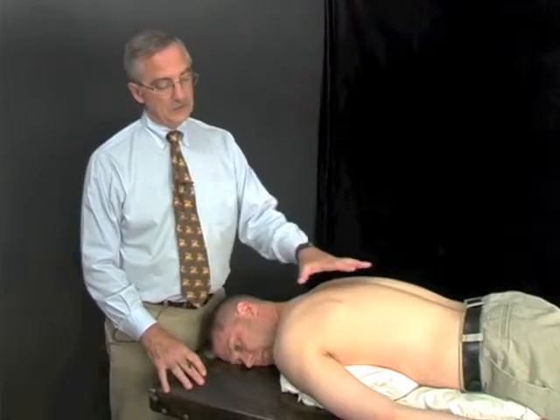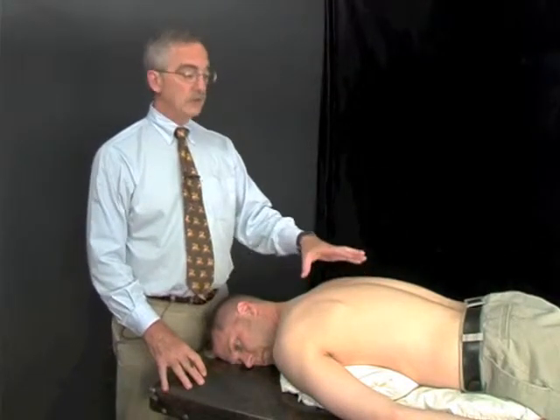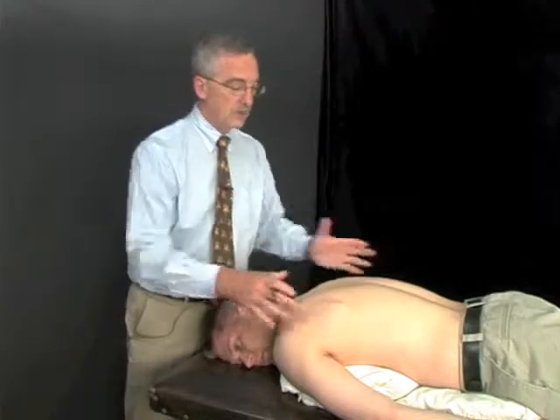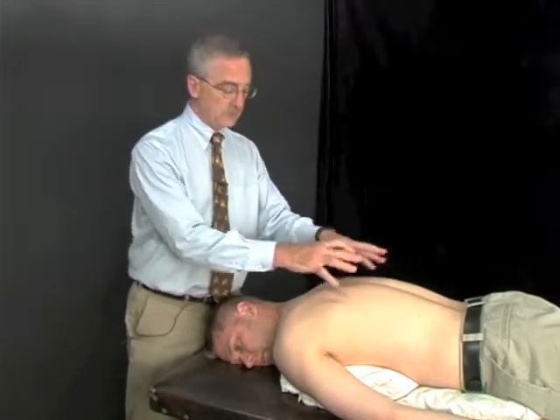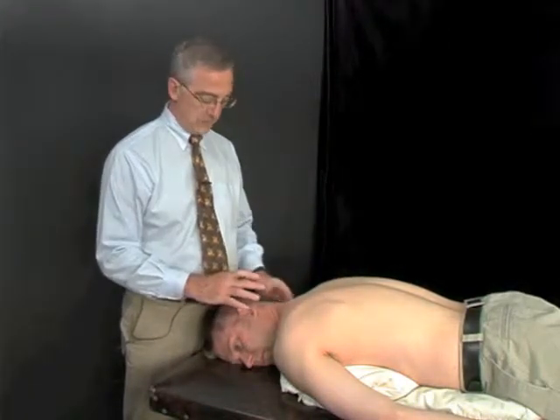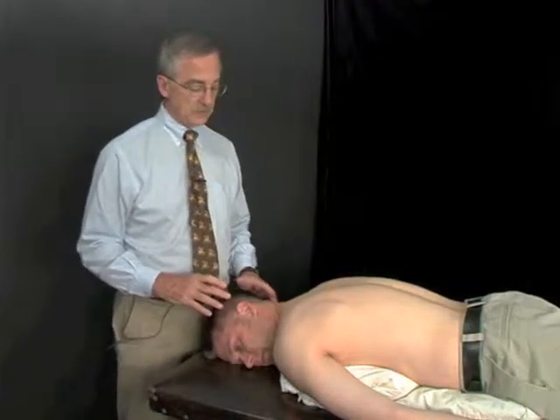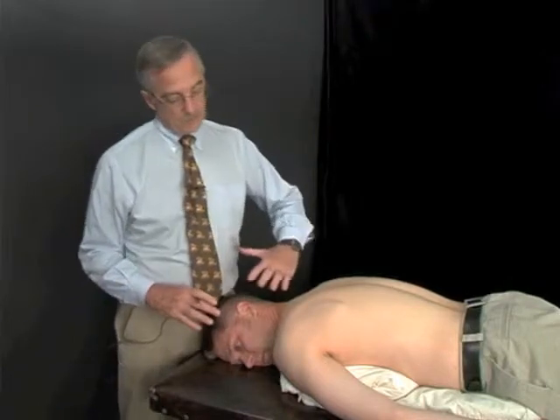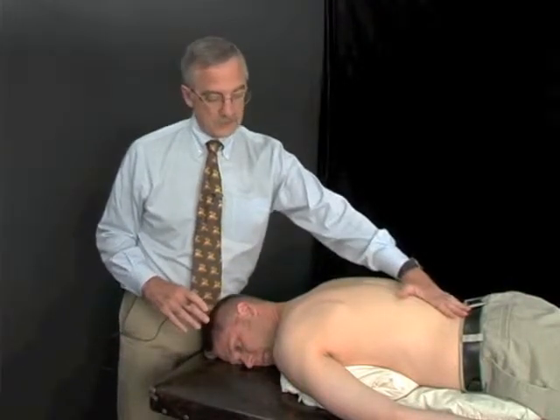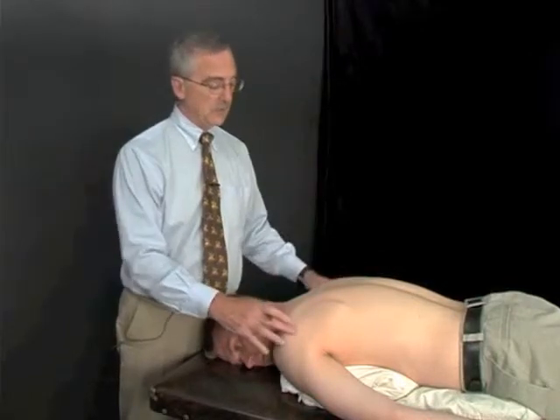When injecting the cervical and thoracic spine, we want the patient positioned with a pillow lengthwise down the body. This elevates the ribs and allows the head to be flexed in a position that eliminates much of the cervical lordosis, giving us easier access to the spinous processes in the cervical area. We want the pillow lengthwise, not crosswise, so the patient can be relaxed.